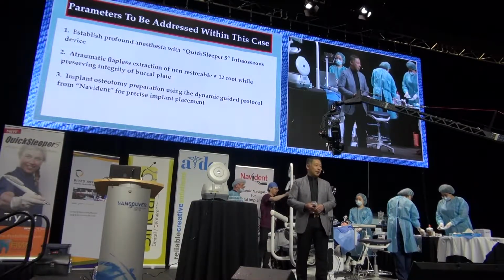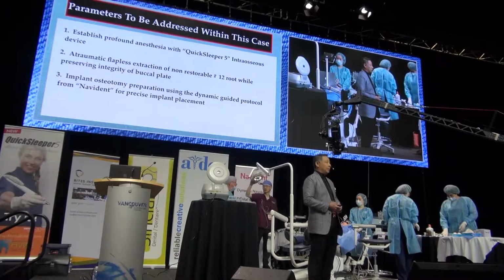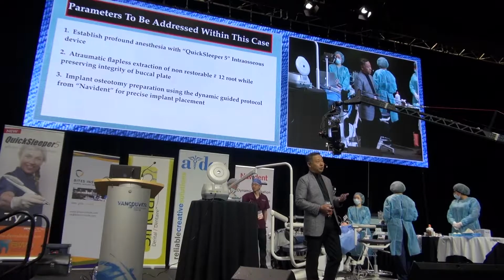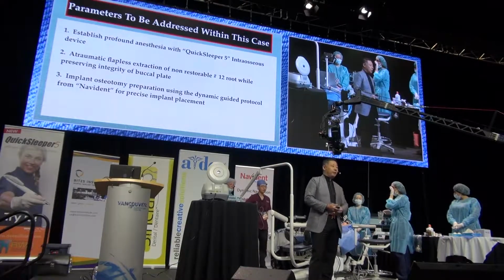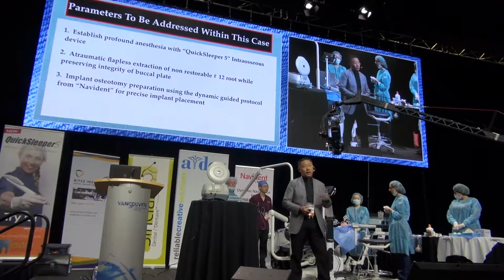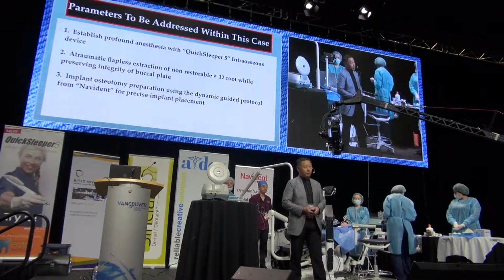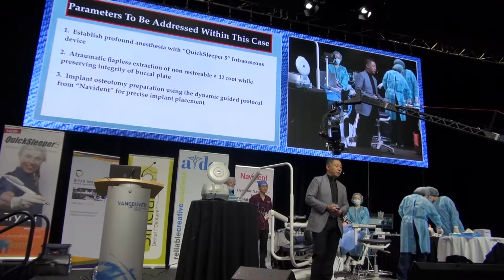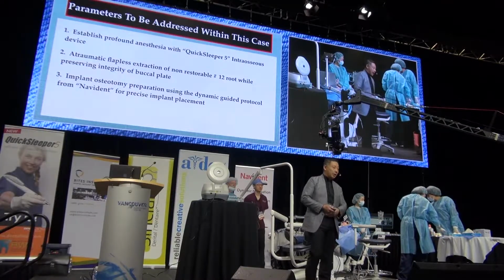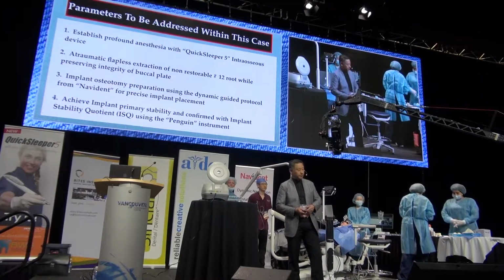We have a dynamic guided procedure. I'll show you what that means. Live time, you can see exactly the angulation, the position, the depth of the drill, staying away from any vital structures, adjacent roots, nerves, and so on. It will be the standard of care in the very near future. And of course, from the patient's perspective, they feel the reassurance and accuracy of what we're trying to do here.